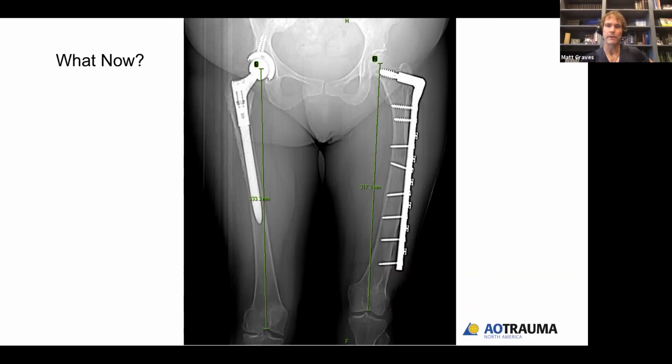The second problem would be osteoporosis. She has significantly thin cortices. From the best I can tell, her trabecular pattern in her femoral head is not good. She has bone defects, especially from the screw for the DCS proximally. That's a significant bone defect, but she also has erosions around the screws along the shaft. She has broken screws. It looks like the distal three or so screws are broken, at least. I may be wrong on that.